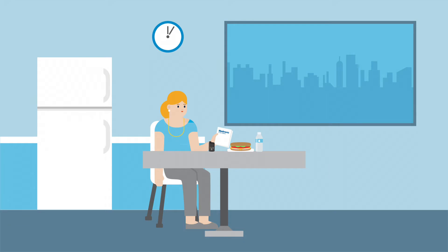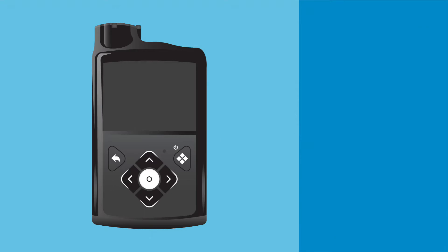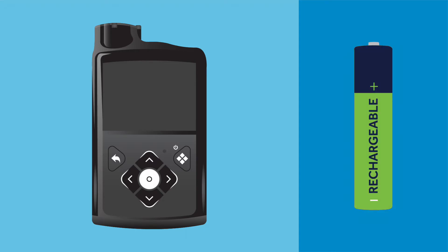Clara looks over the training materials and sees the first thing she'll need to do is insert the battery. The pump is powered by a single AA battery, which can be either a lithium, alkaline, or rechargeable battery. It should be new or fully charged and at room temperature.